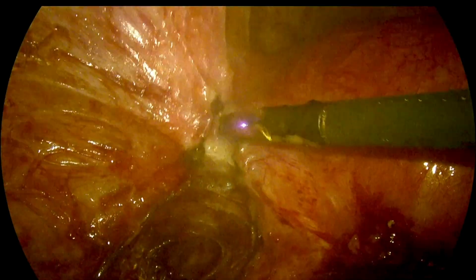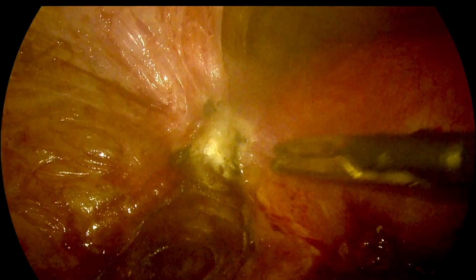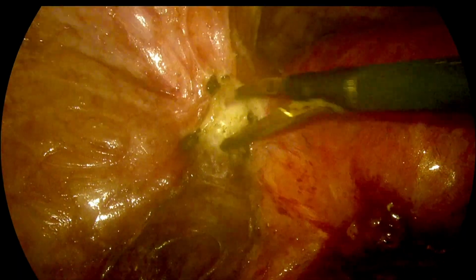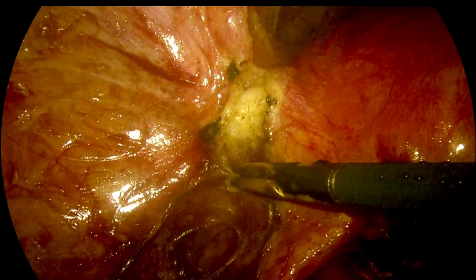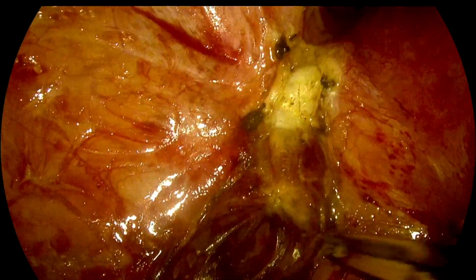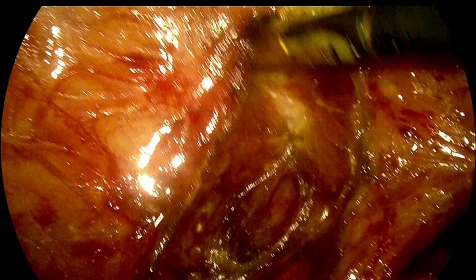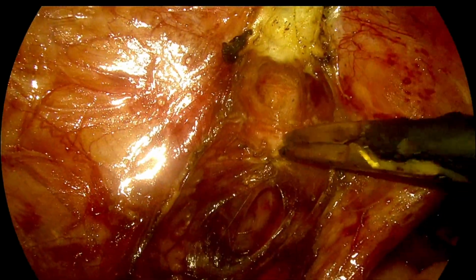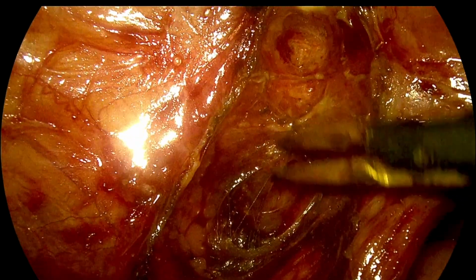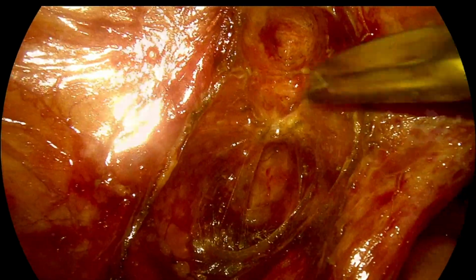So these are the peritoneal adhesions near the anterior part of the uterus on the left side. They are all thick and fibrotic and do not divide easily. So we are trying to identify the ureter on the left side. Once we can identify that, the dividing of the peritoneum becomes faster and easier.